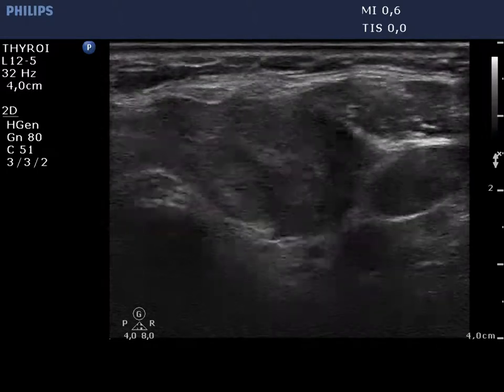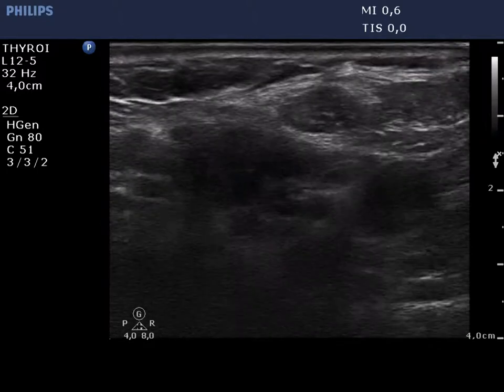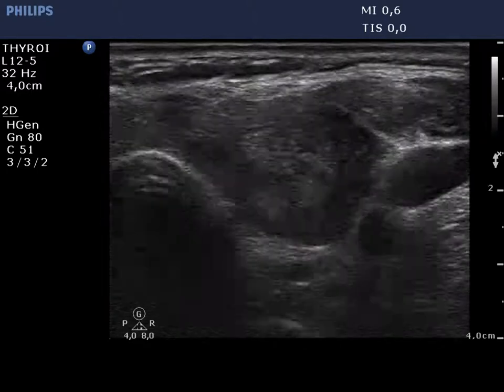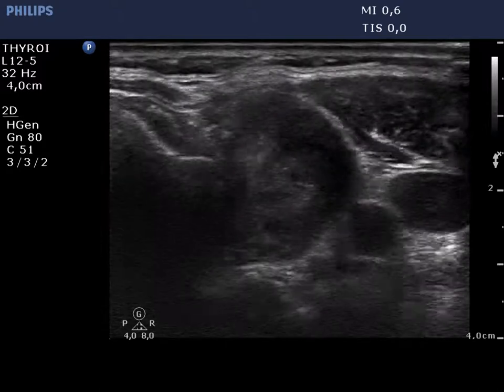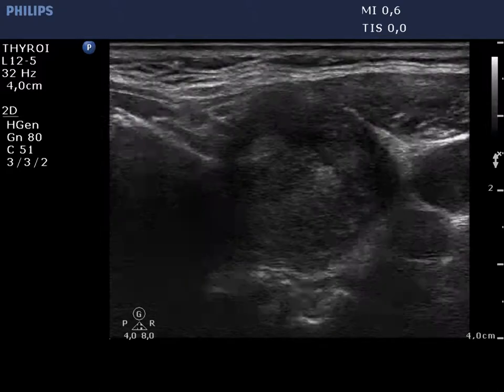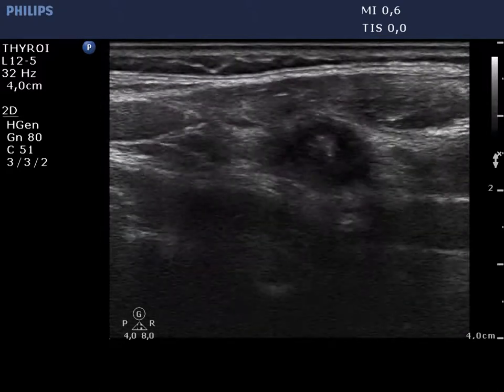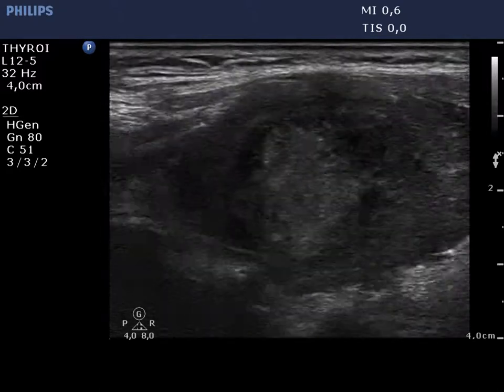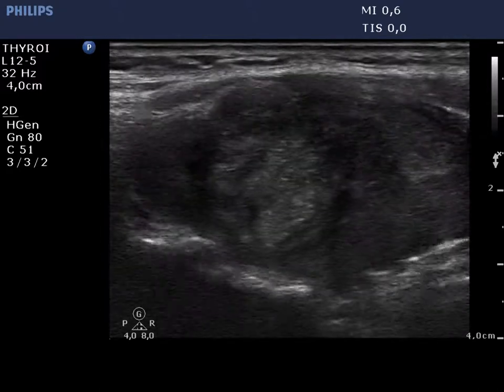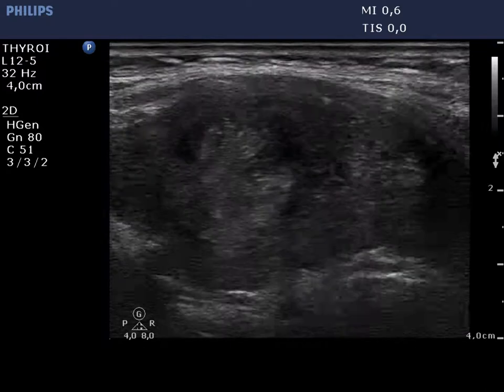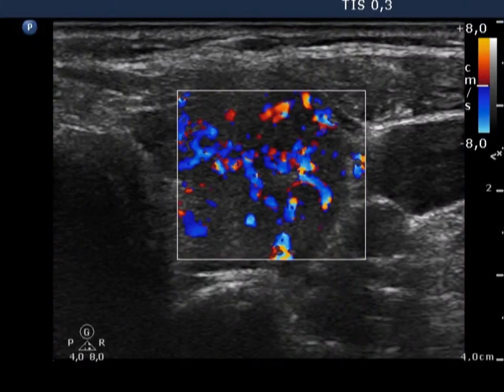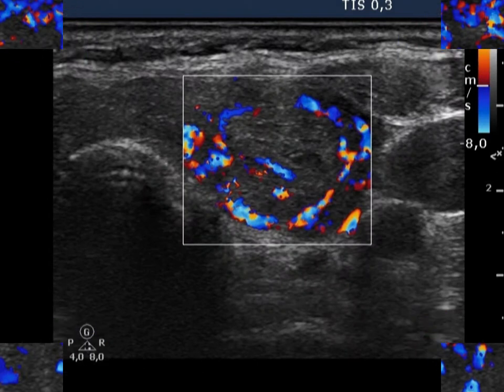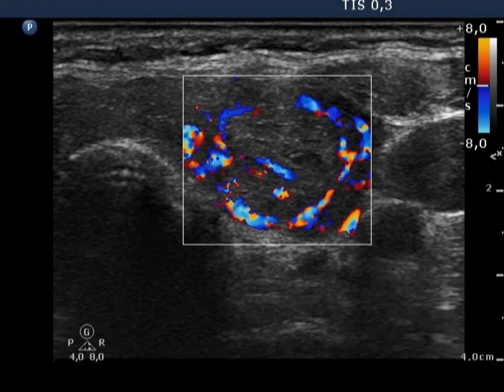There are two hypoechoic lesions in the left thyroid, one in the lower and one in the middle part of the lobe. The extranodular part of this lobe is also hypoechoic and displays increased vascularization. The nodule presents paranodular blood flow.